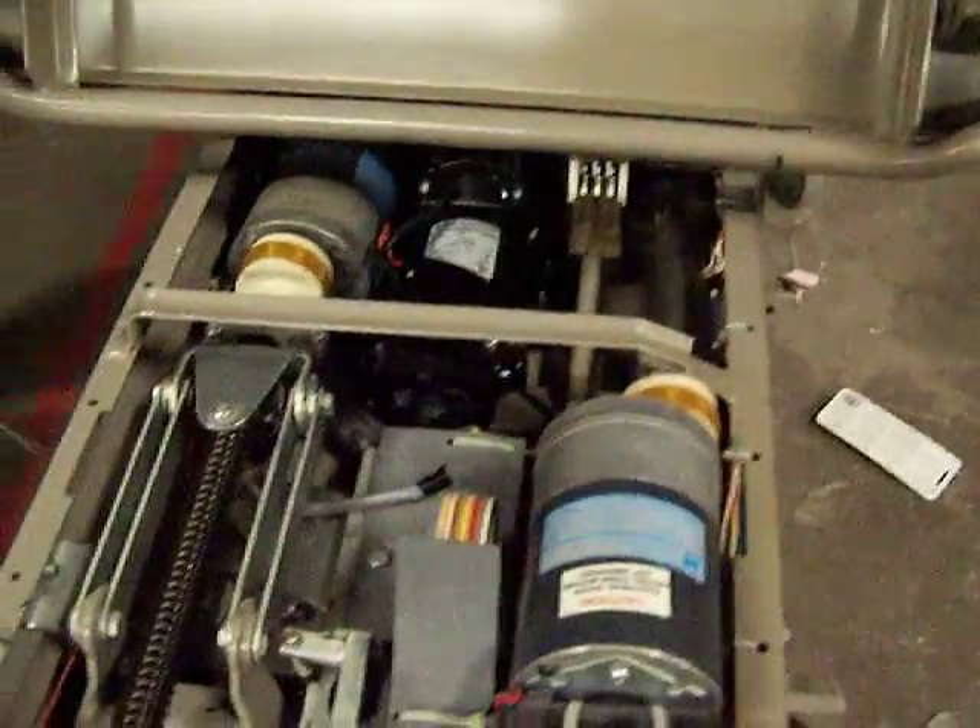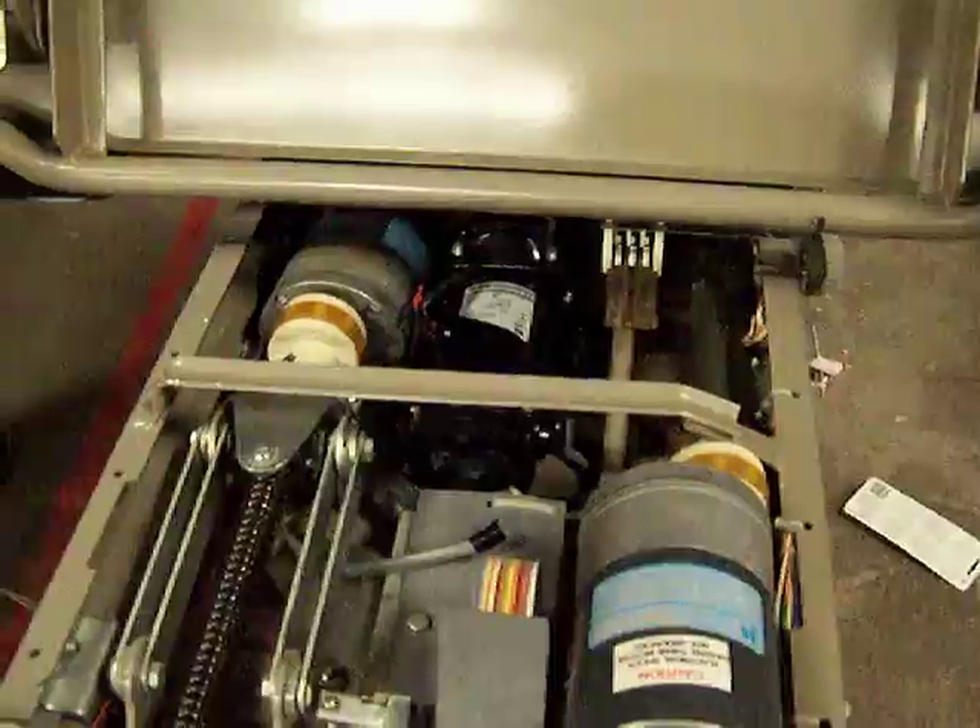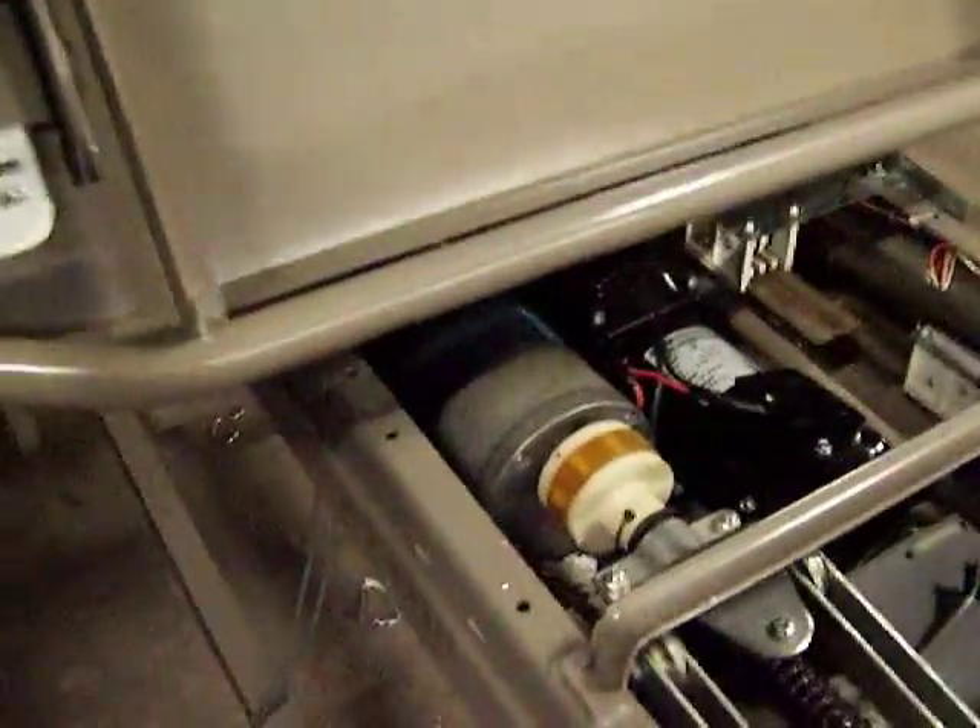If you want to see the final design, you can see our motor — the new motor in there — and the circuit board is right under everything else and controls how the bed works, with the joystick connected to it. And that's our final design. Thank you.